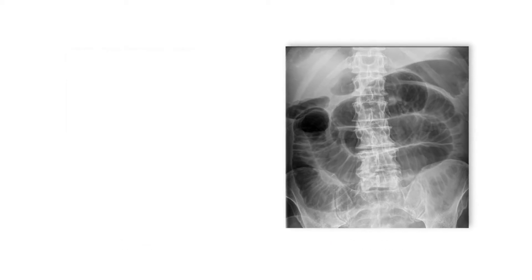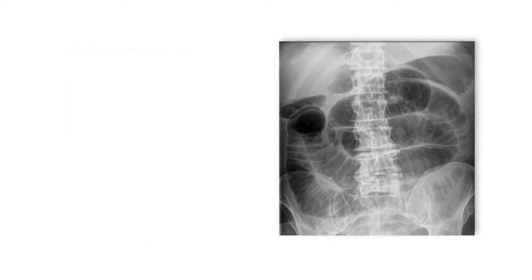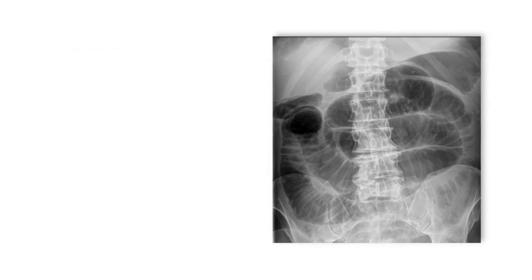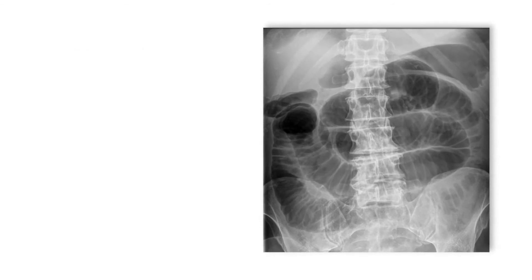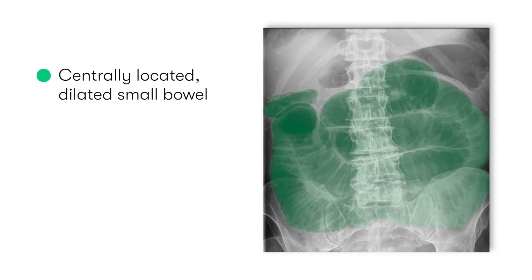Looking more closely, in abdominal x-rays of small bowel obstruction, the features we normally expect to see are centrally located dilated small bowel with a diameter of more than 3cm.